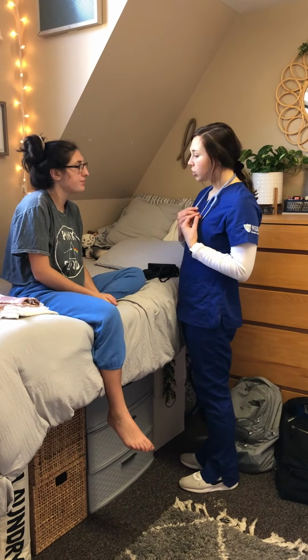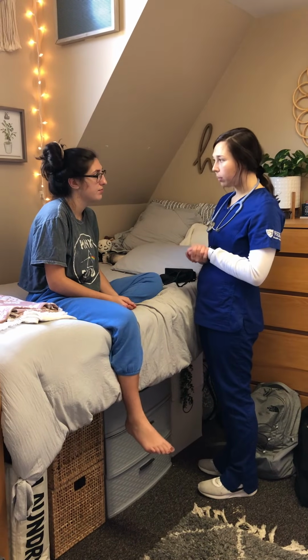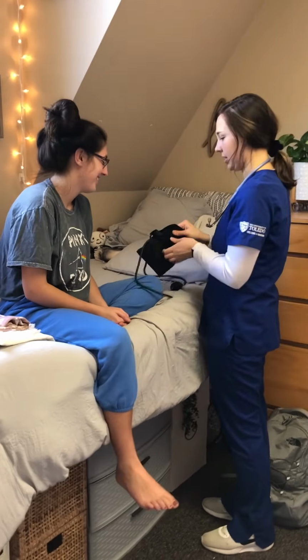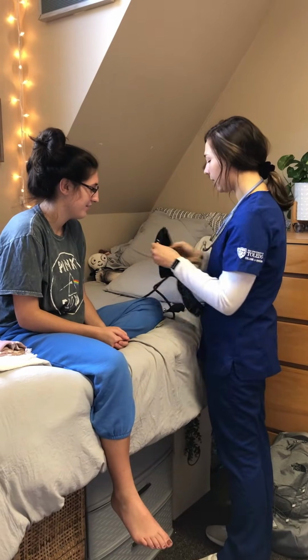So is there any restrictions why I would not be able to take blood pressure on a certain arm? No. Can I ask what your normal blood pressure usually is? 120 over 80. Okay. So I'm going to take the blood pressure on her left arm.